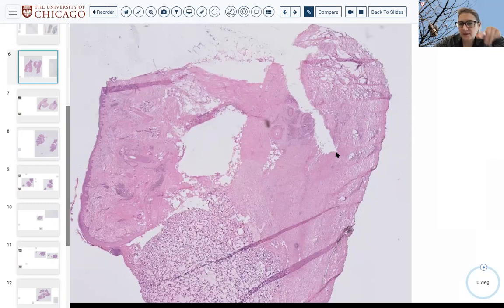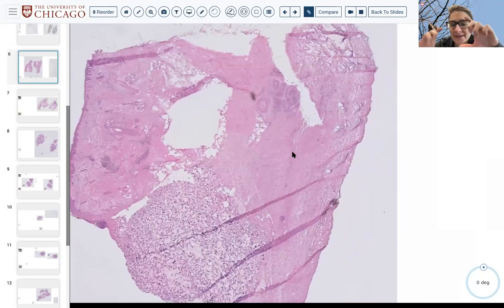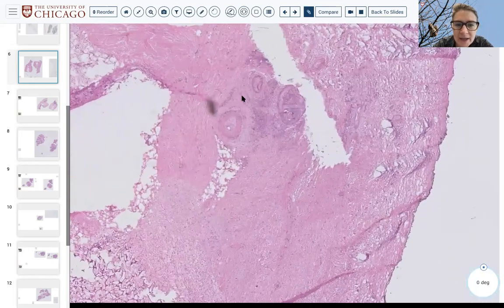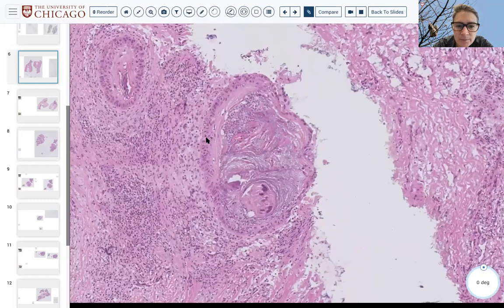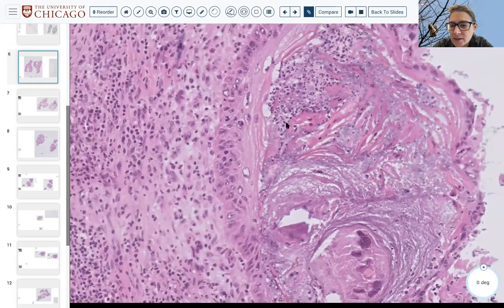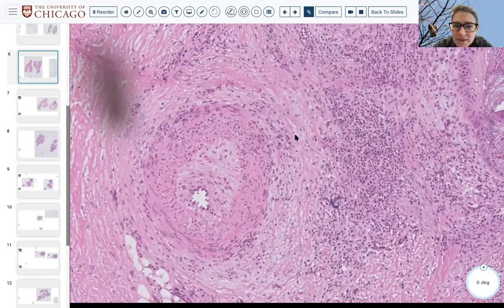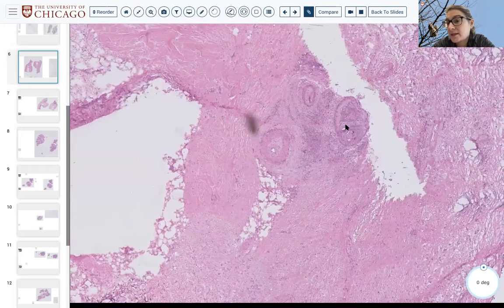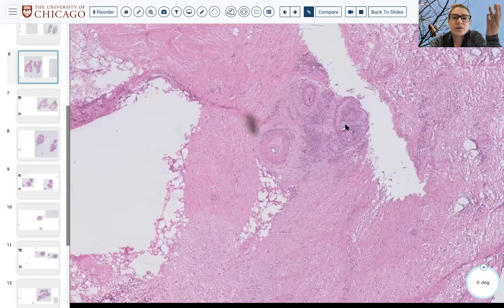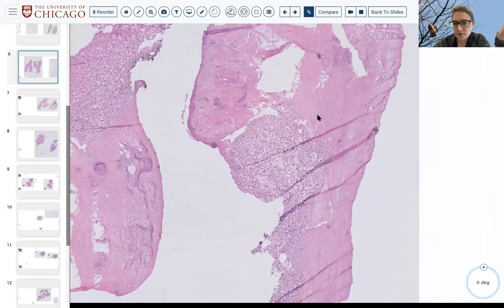So this is a perpendicular section through the lesion, which is previously ulcerated, previously operated skin, and adjacent nearby you see these very deep nests of thin but very highly atypical islands with mitoses, dyskeratosis, nuclear hyperchromasia, pleomorphism, keratin crud. Here's even a little activated muscular vessel. So yes, we got lucky because in this case your tumor is essentially only microscopic, because all of your macroscopic disease has been resected and you're left with ulcer and gel foam.